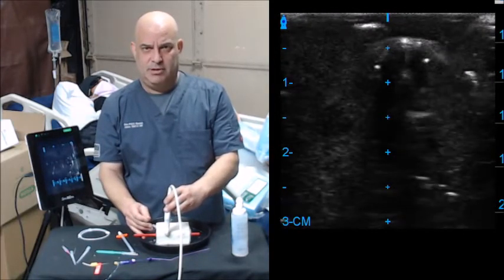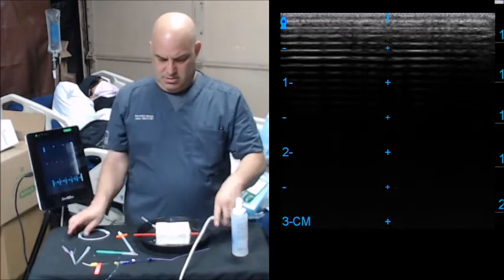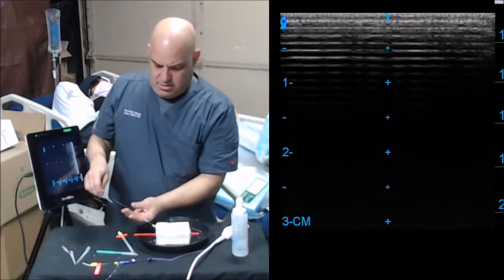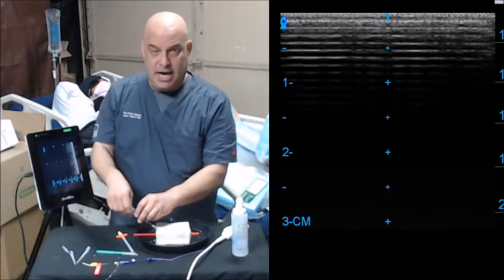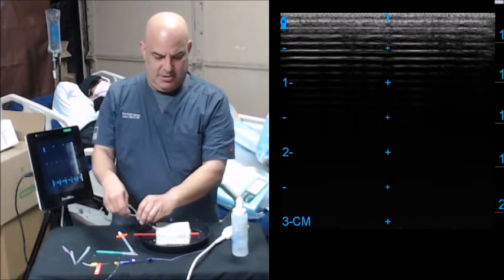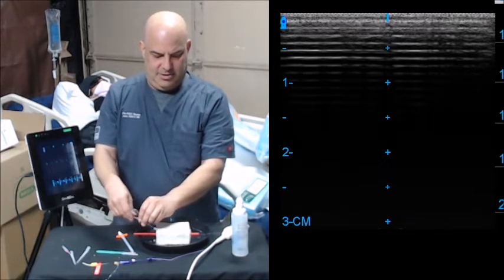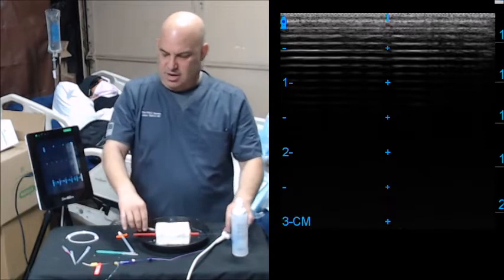Just follow my needle tip right there, advance my guide wire, drop my sharp.